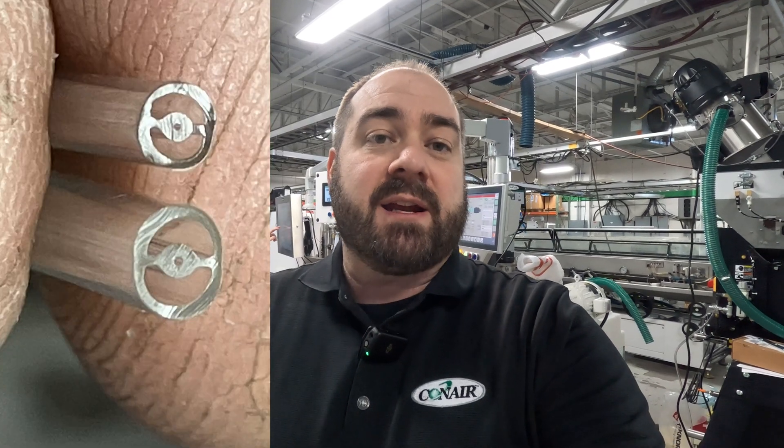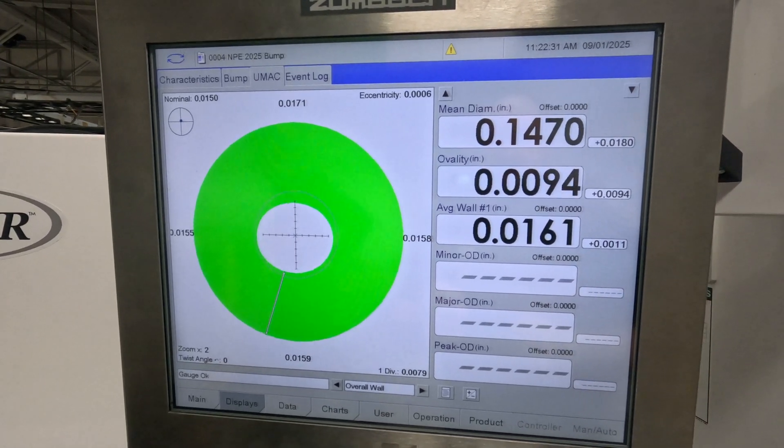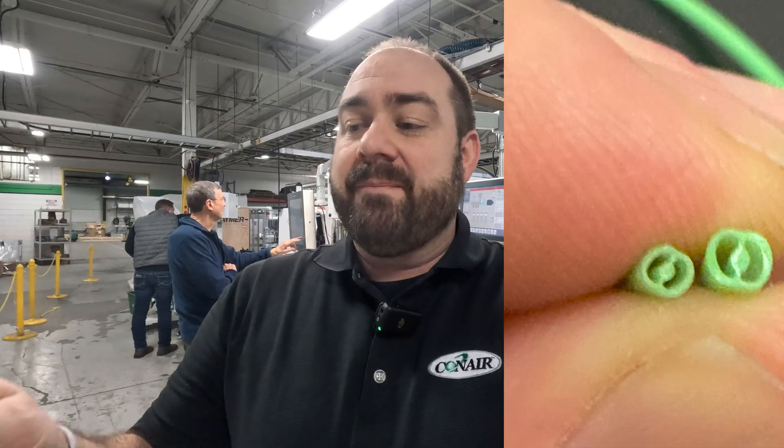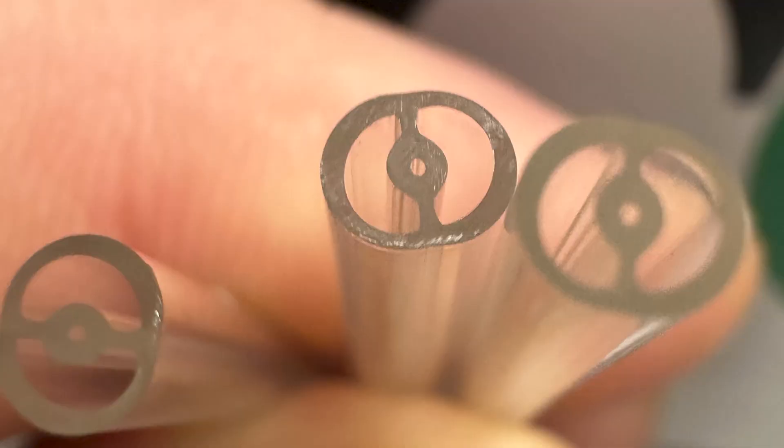The tip is 110 thousandths outer diameter. The body is about 140 thousandths outer diameter, so we're increasing our size from 110 to 140 thousandths. And in the center, that tiny little hole is 5 thousandths ID diameter. Make sure you stop by booth 4320 in the Anaheim Convention Center, February 4th through 6th for the MD&M West Show.